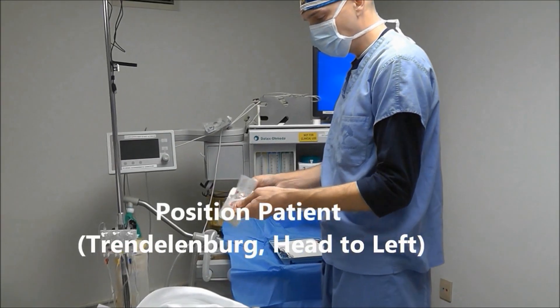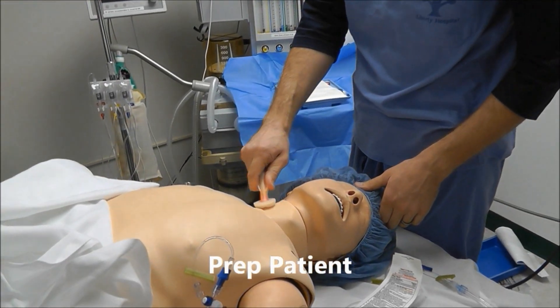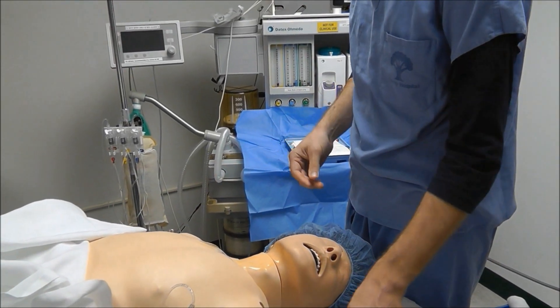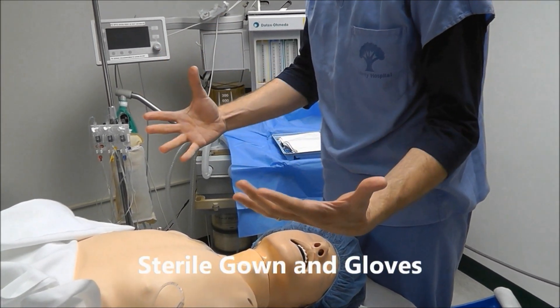Now that my kit's open, it's time to prep the patient. When I'm prepping, I start in the center and do circular motions and prep outwards. Now that the patient's prepped, I'm going to put on a sterile gown and sterile gloves.